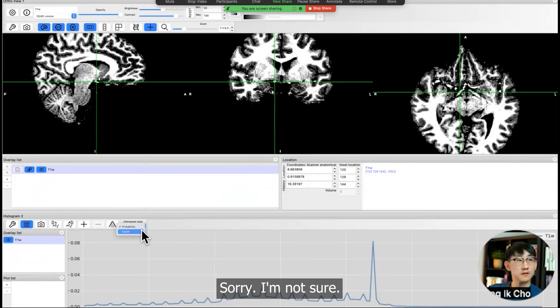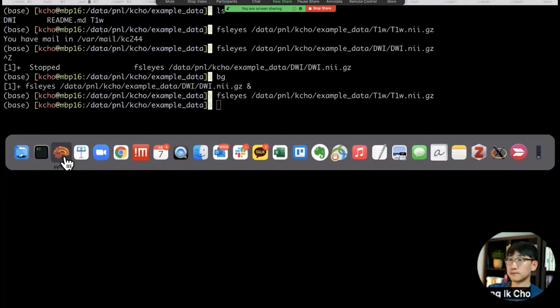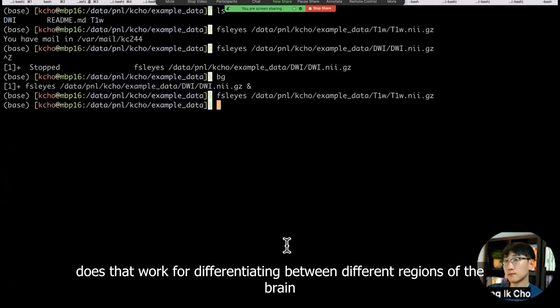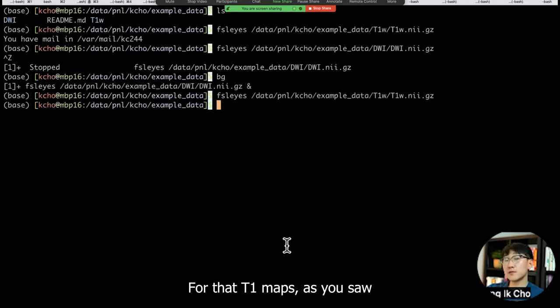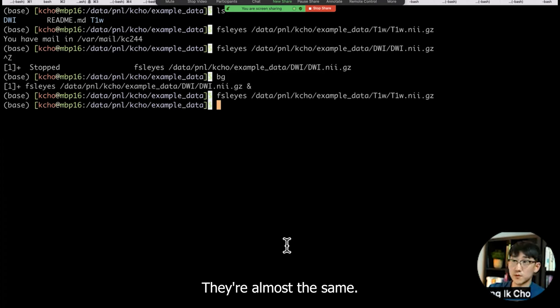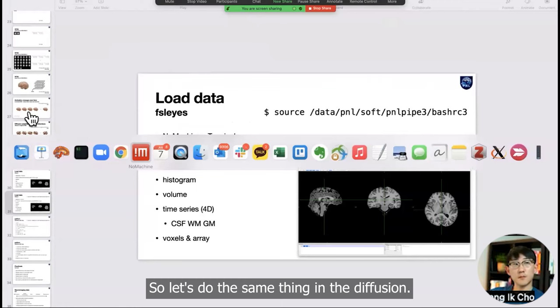In terms of differentiating between the different intensities and colors, could that work for differentiating different components of the brain, or is it only useful in terms of white matter? For the T1 maps, as you saw, the brightness differences between different structures like frontal and temporal is not so great. They are almost the same, so you won't be able to use that information.